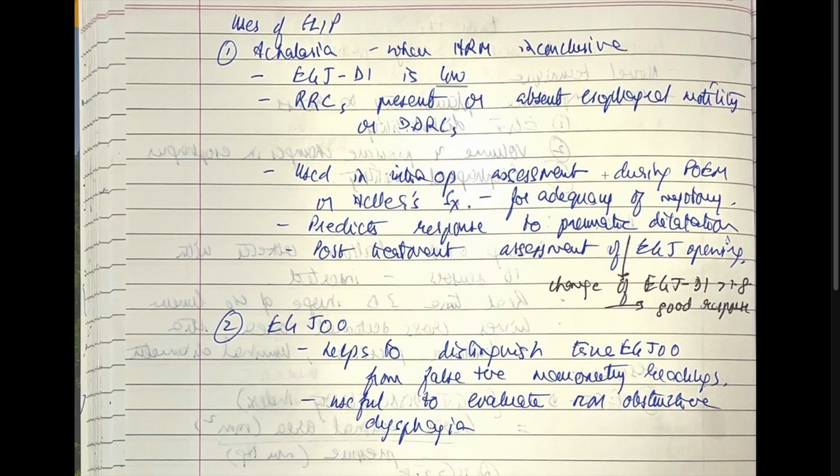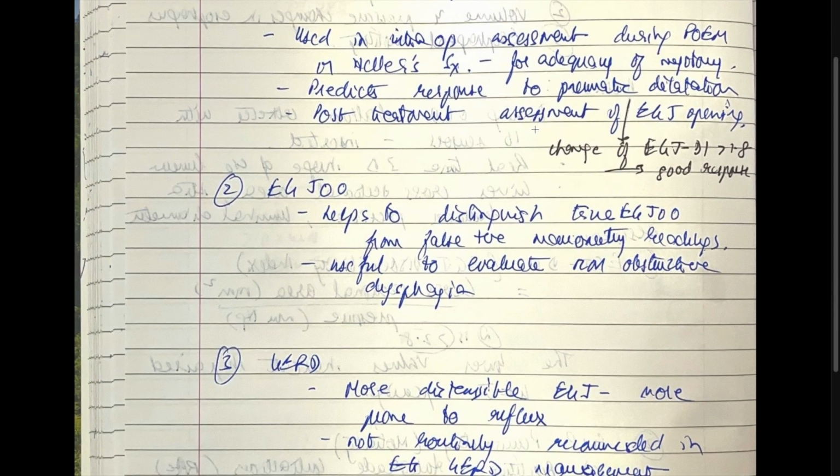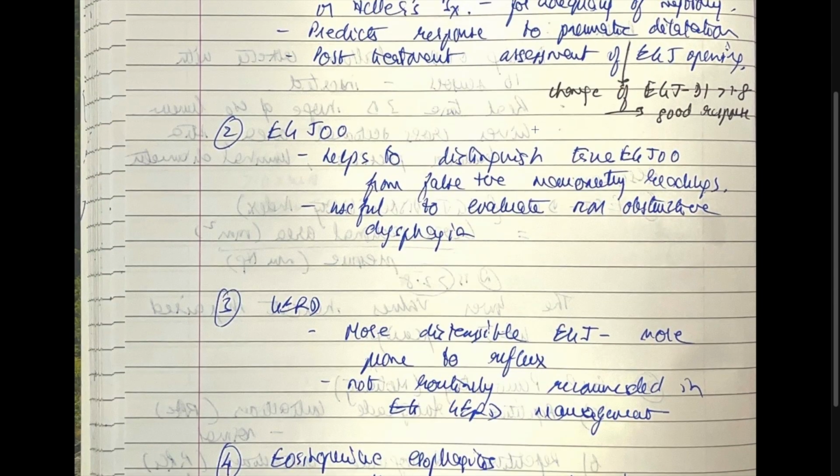It can predict the response to a pneumatic dilatation as well. So a change of EGJ-DI of more than 1.8 gives a good response. Post-treatment assessment of EGJ opening is also done in achalasia in FLIP. EGJ outflow obstruction. It helps to distinguish a true EGJ outflow obstruction from a false positive with a manometry reading.